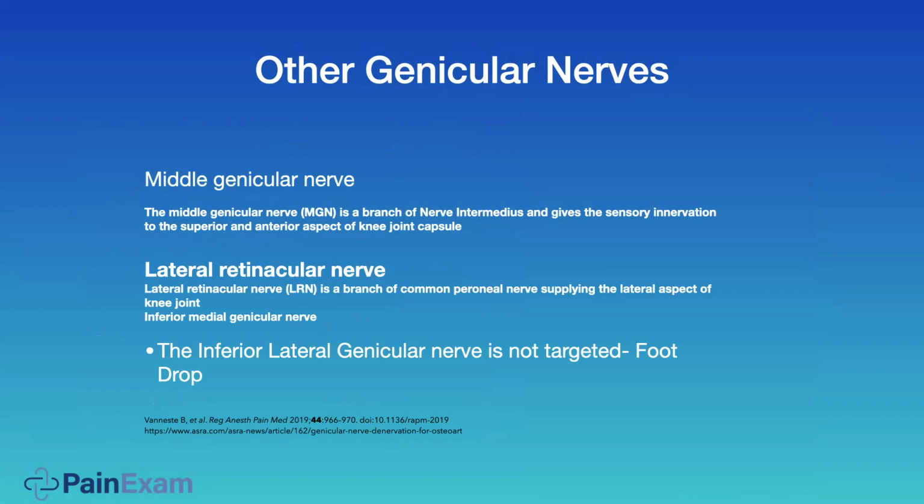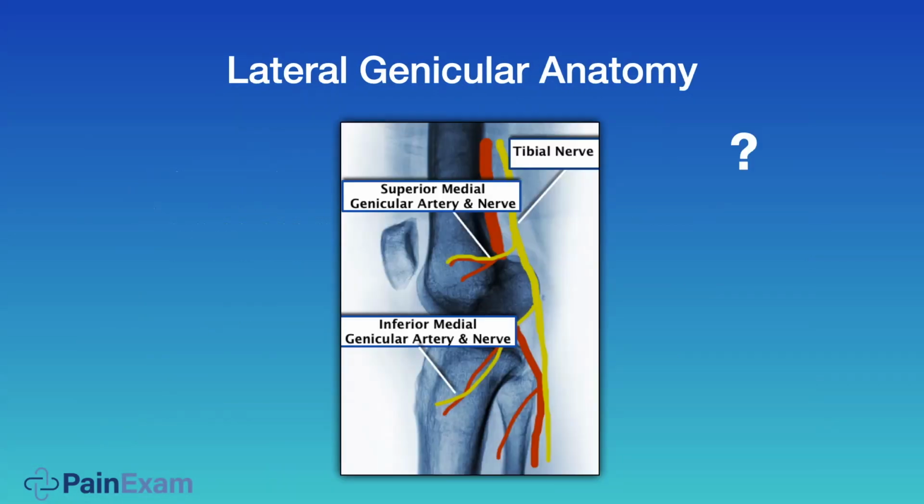Here are my references. Once again, there's a big question mark because of the origin, but in terms of the lateral view, this is the idea. I know it's an ultrasound course, but I want you to understand the anatomy with the fluoroscope, because this is how most of us pain doctors learn how to do these blocks. And now ultrasound is what I think is the preferred way.